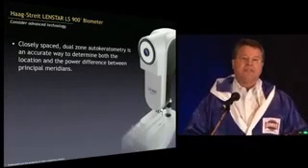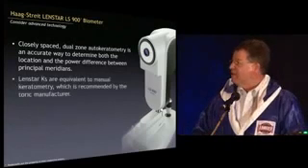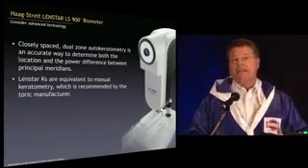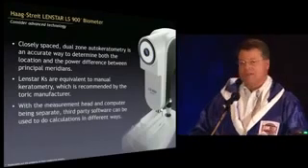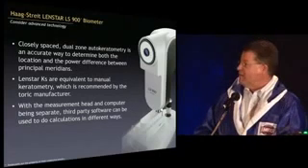So just in quick summary, I think the Ks on this instrument are spectacular. The axial length measurement capability is the same as the IOLMaster. The numbers come out the same. It's equivalent to manual keratometry, so this is the first validated instrument equivalent to manual keratometry that you can work with for the toric IOL, and that's what's recommended by the manufacturer.